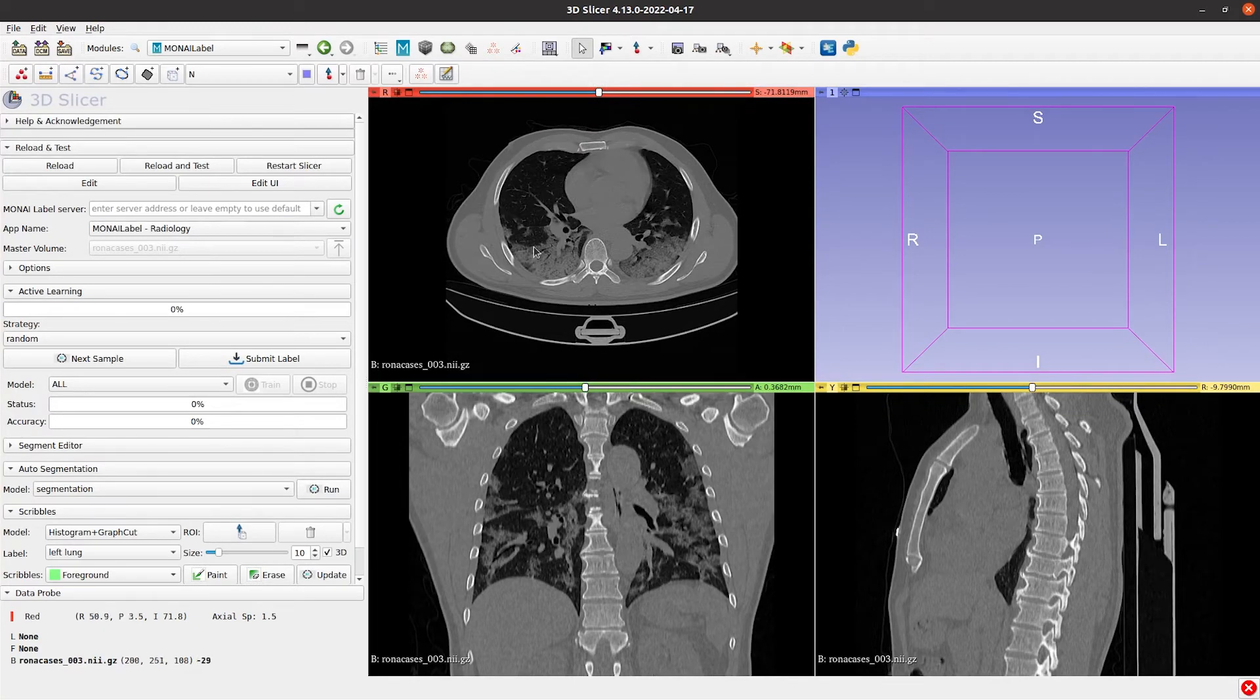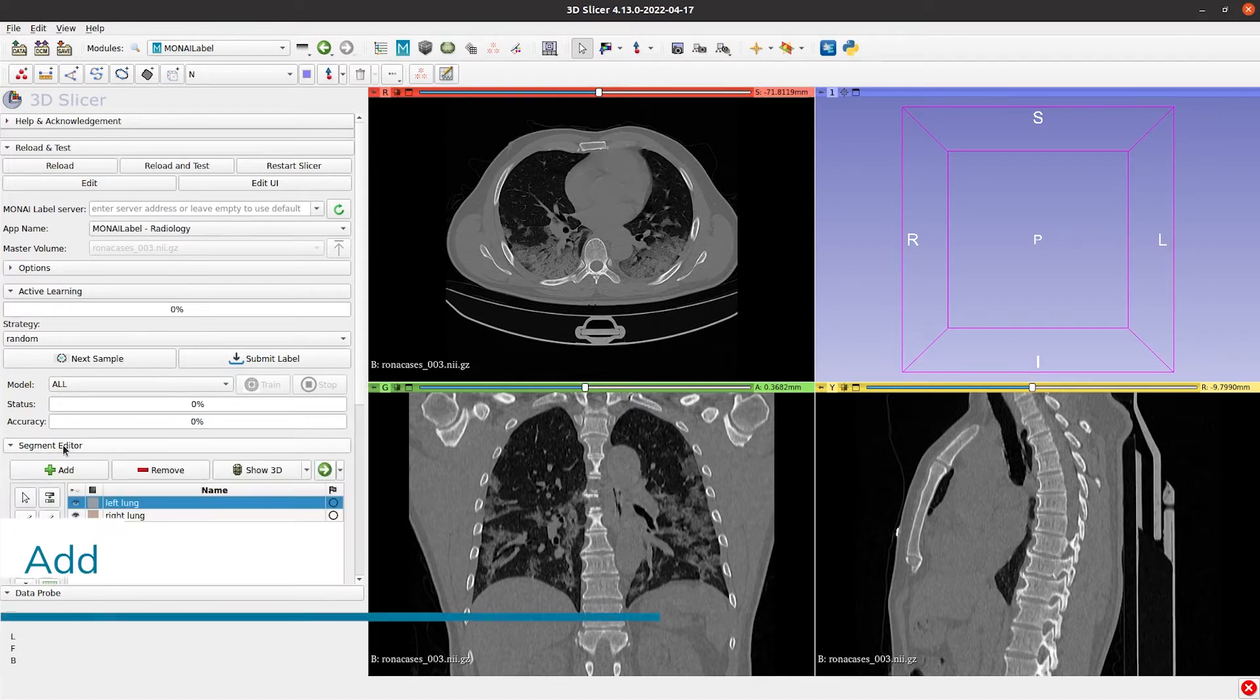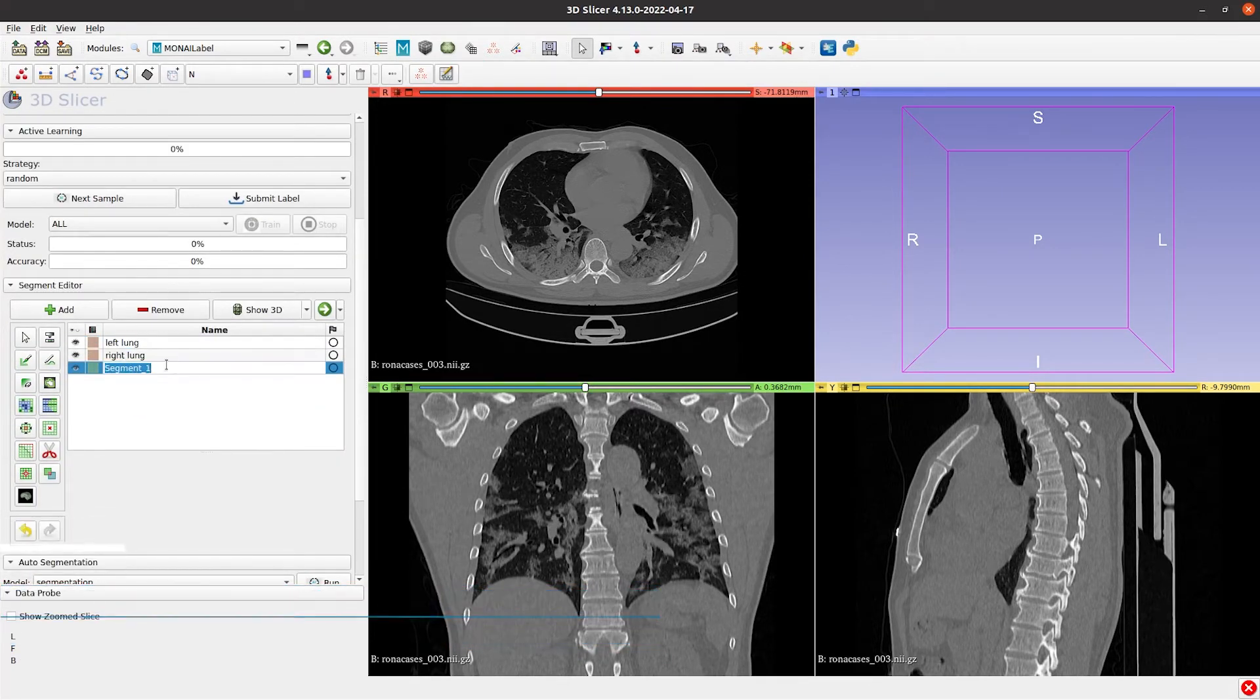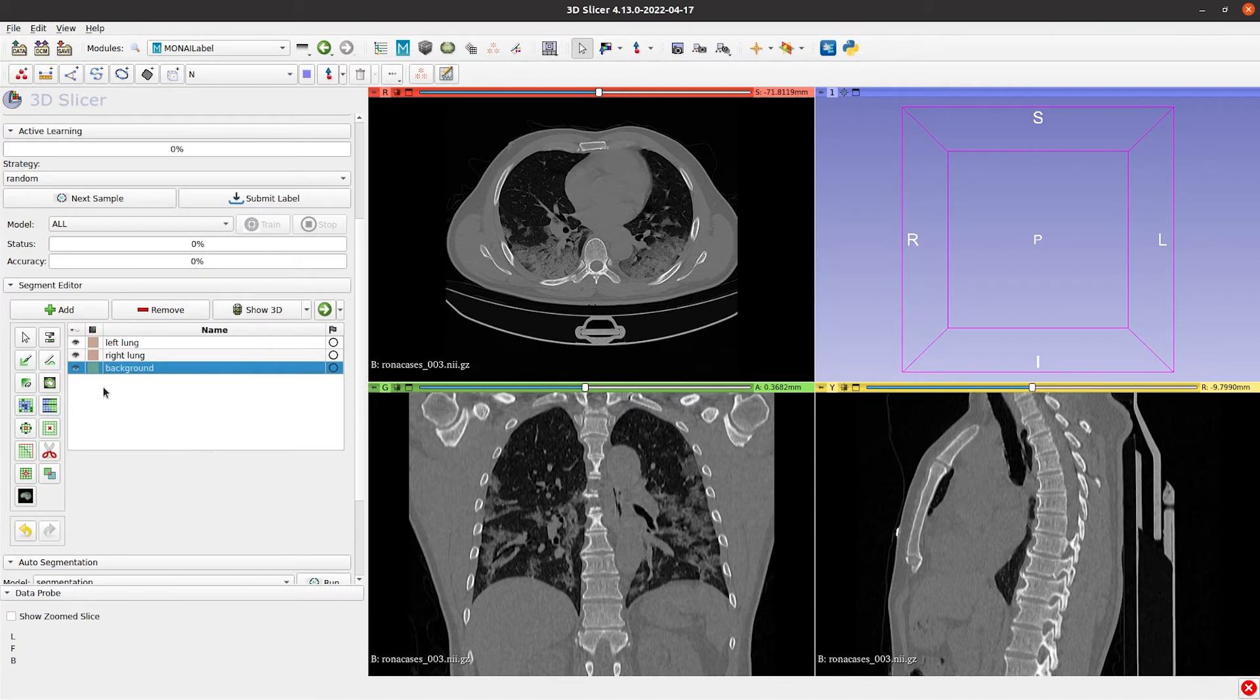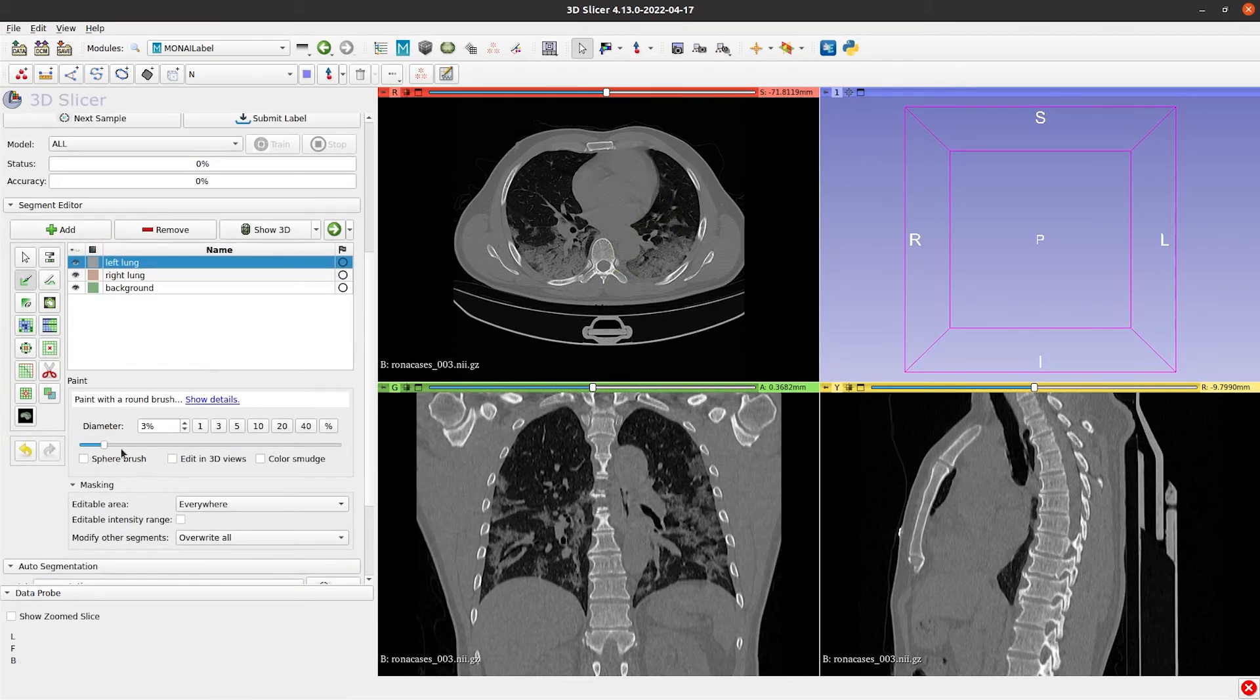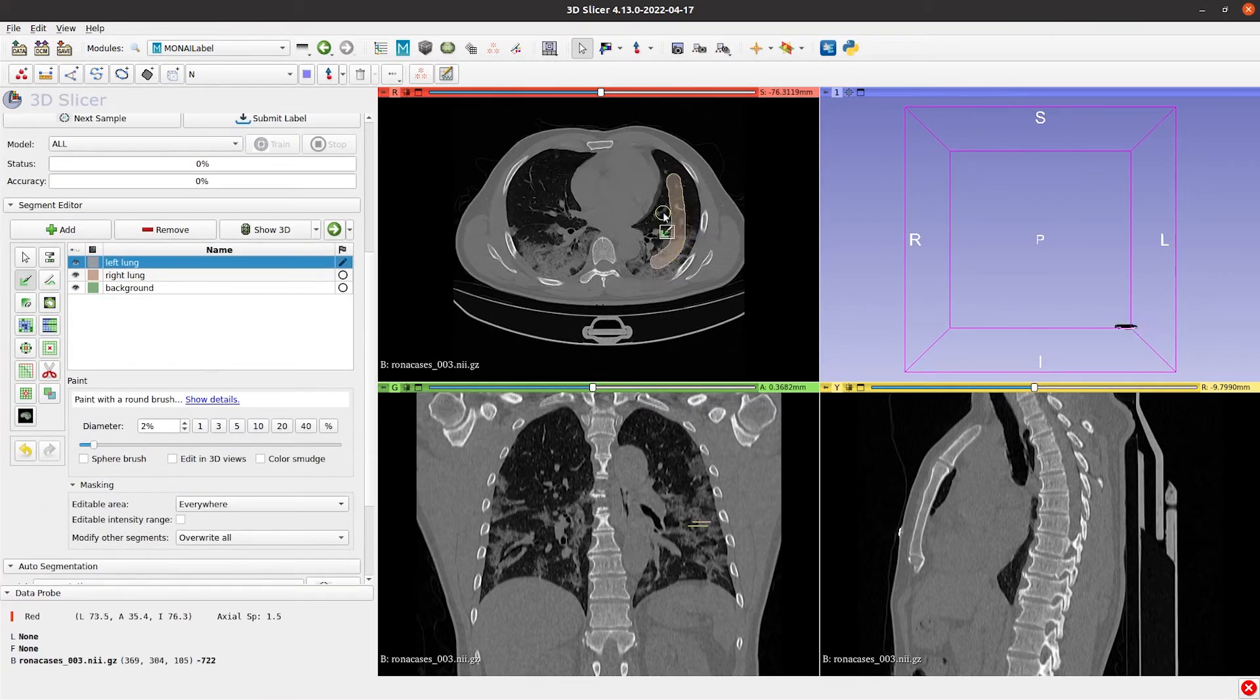In this video, we'll use the Grow from Seed functionality to create the labels. For this, we create the background label and then add the Seeds to the organs we want to segment, the Lungs in this case.